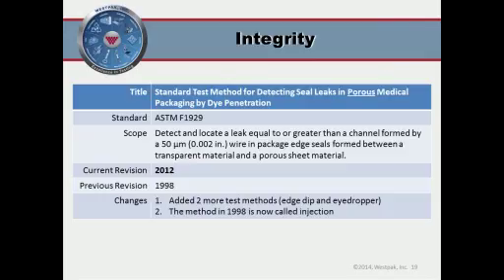Great. Thanks, guys. One more question on the dye penetration test. Do you get additional information from dye testing versus gross leak bubble testing? That is a great question. So we are only on integrity testing, and then I will go over more in detail for the bubble testing in a couple slides. So in case I forget, Greg will have to remind me about the question again. So hold on. Okay, will do, Katie.